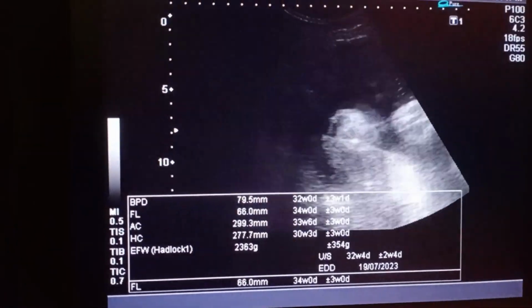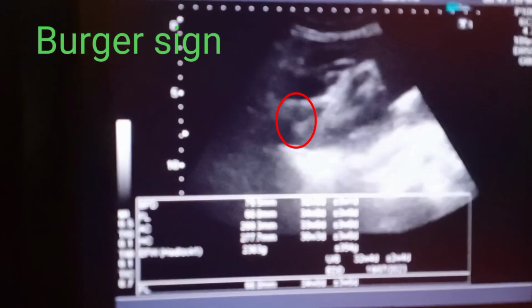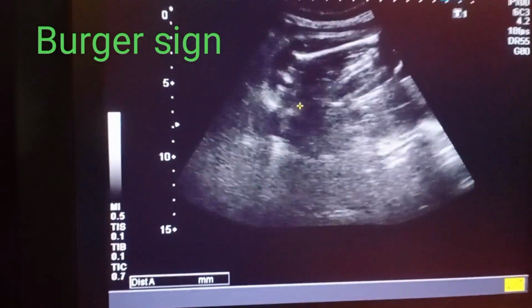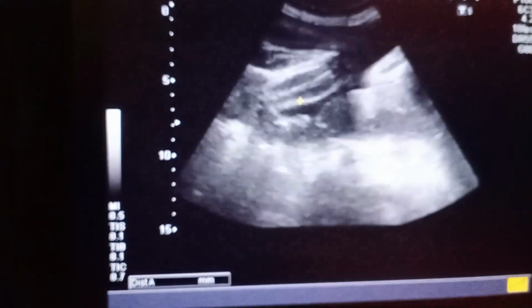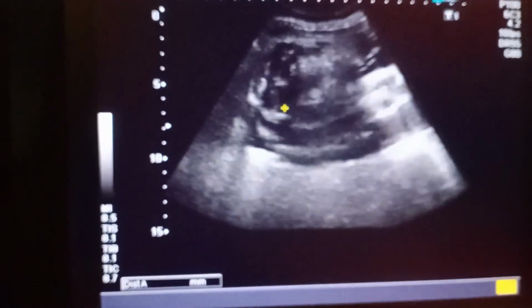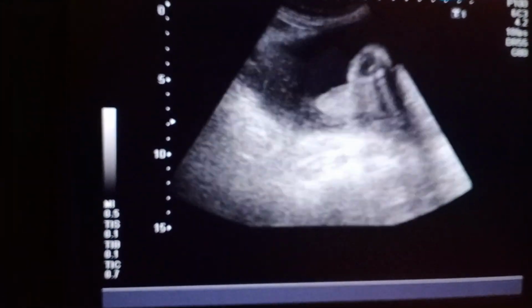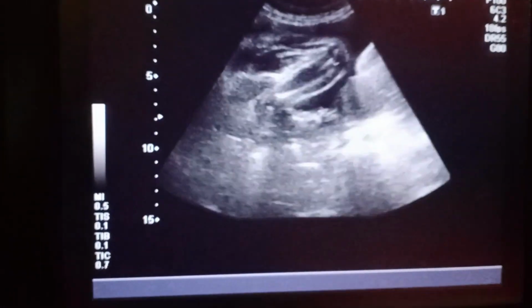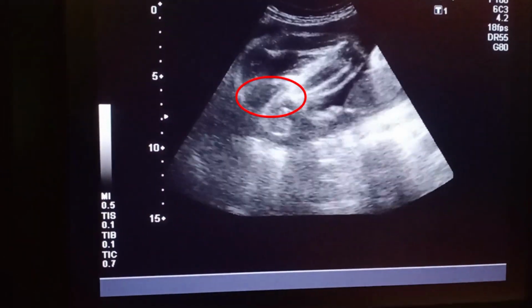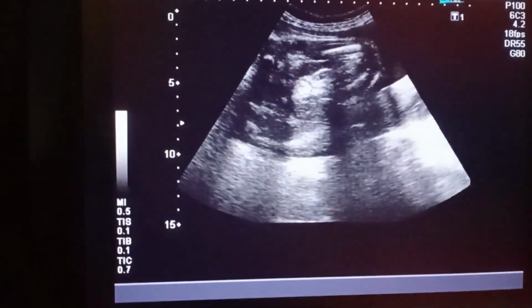Now I would like to focus on both femur bones. This is the burger sign. See it. This is the burger sign that shows the gender of the female baby. Our mother is very happy because she has two male babies. Now she is happy to have the female baby.